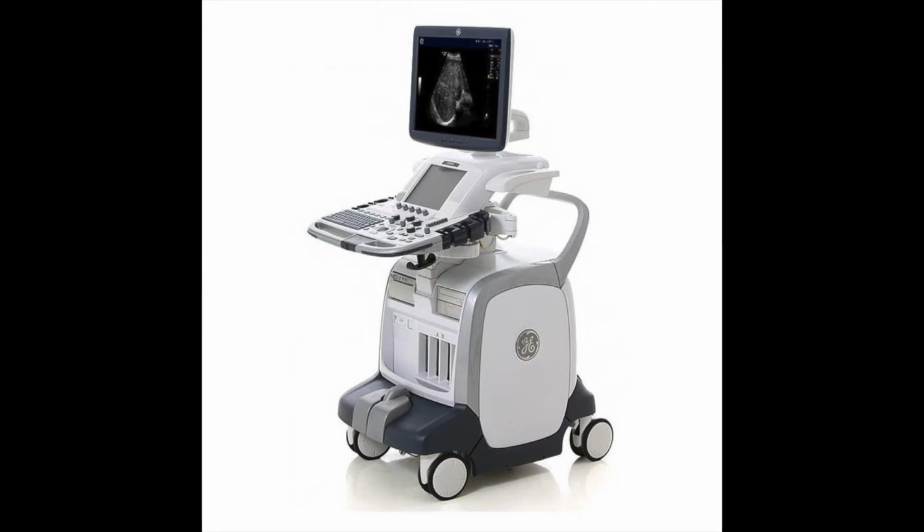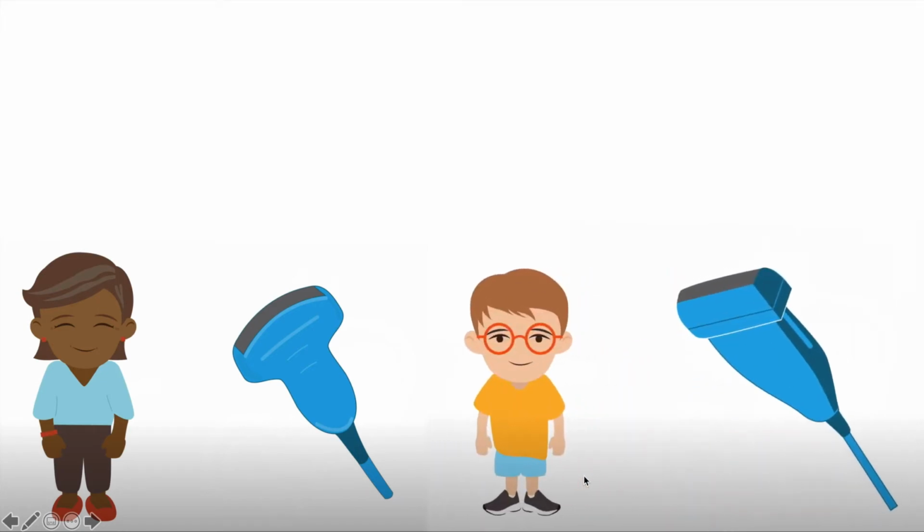The equipment needed to perform the scan is an ultrasound. For an adult, a low-frequency, 2 to 5 MHz, curvilinear probe is used in the abdominal setting. For children or patients less than 40 kilograms, a high-frequency linear probe is used in the vascular setting.